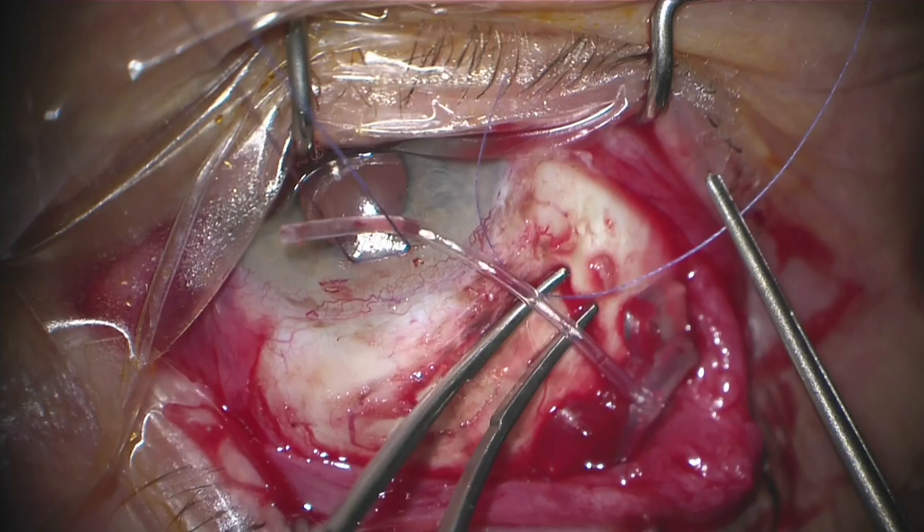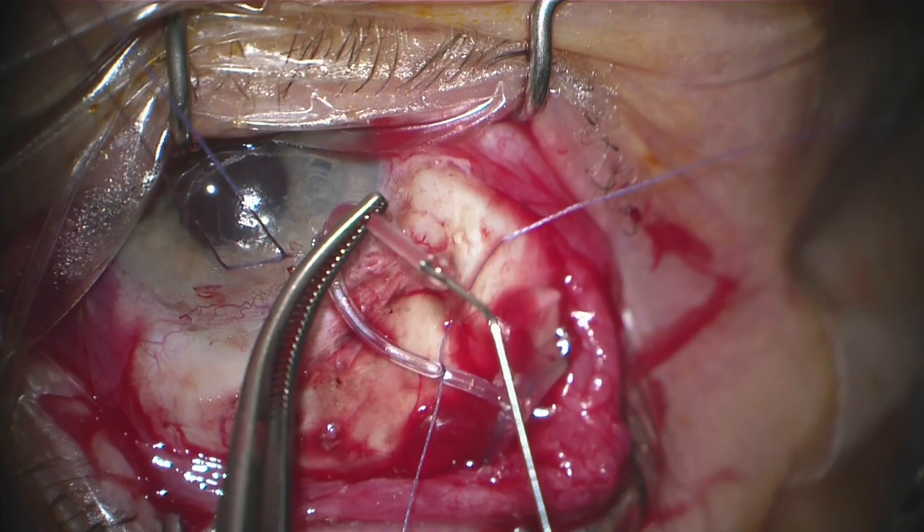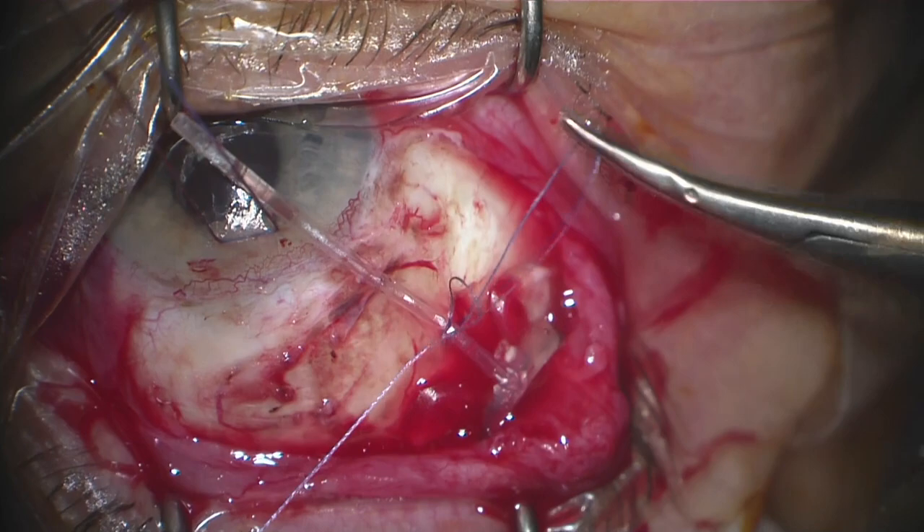One of the nice things about the Multino is that it really hugs the globe nicely, so as you tuck it back into the quadrant it really doesn't move forward all that much. That makes it a little bit easier as you're performing this step, which is placement of the temporary ligature to allow time for the implant to encapsulate.